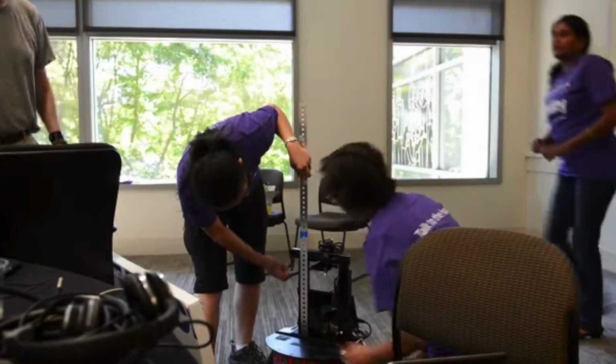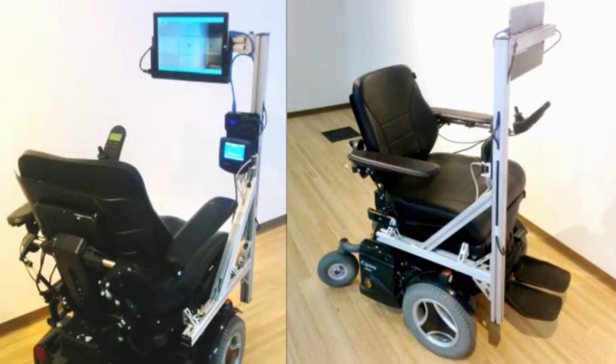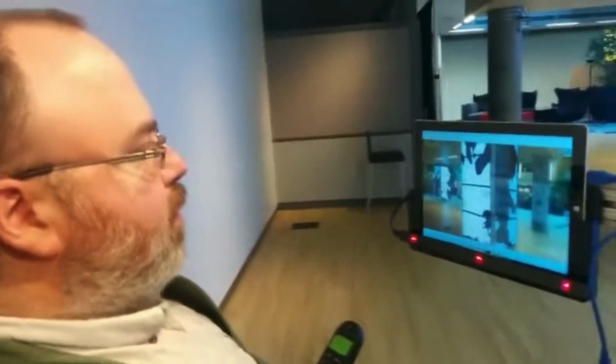Microsoft created a research prototype that demonstrates the feasibility of eye-controlled wheelchair navigation. That work inspired Team Gleason to independently pursue developing a system to enable control of wheelchairs via eye tracking.